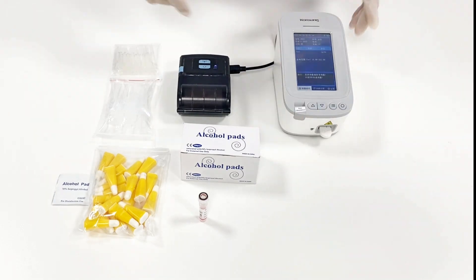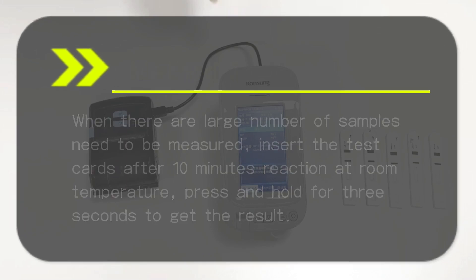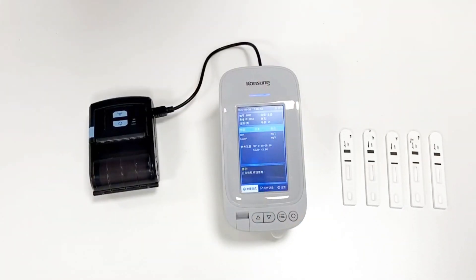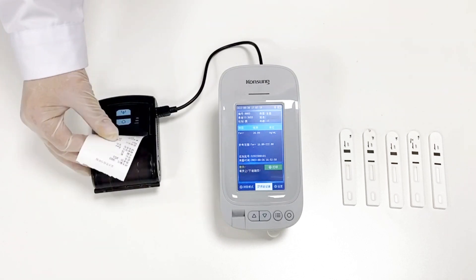If there are a large number of samples to be measured, insert each test card and allow reaction at room temperature for 10 minutes. Press and hold for 3 seconds to get the result.